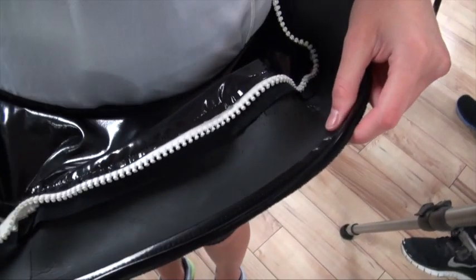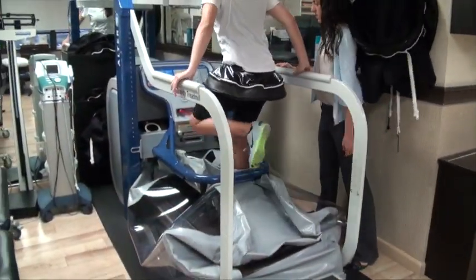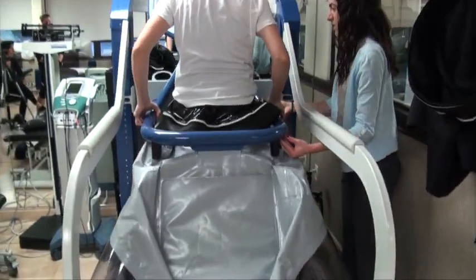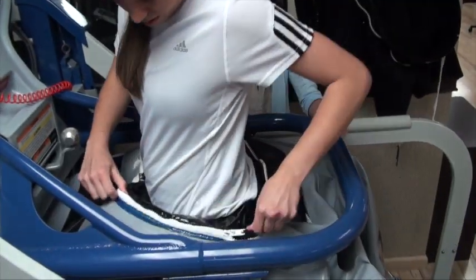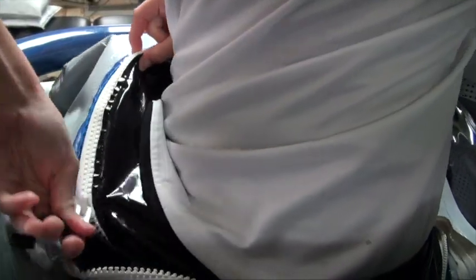You first must put on the Alter-G neoprene shorts before stepping into the treadmill. The chamber is then raised up to the appropriate height dependent on the amount of support and comfort of the patient. The shorts are then zipped and attached to the frame.